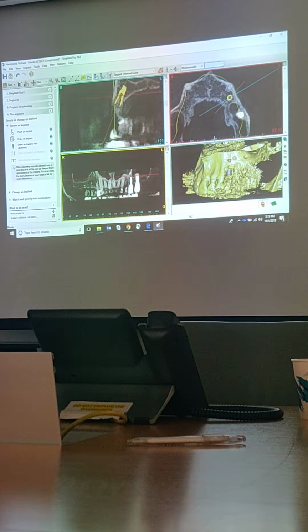So every patient can be open. How open? What would be our instruction? Just teeth not touching? 7 to 8 millimeters. 7 to 8 millimeters is on average. Usually the biting stick has a diameter of 3 to 4 millimeters. The patient either bites it on the front, or you have this little biting stick that comes with the CBCT scanner, or a cotton roll.